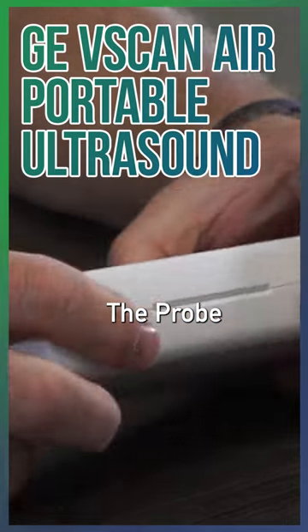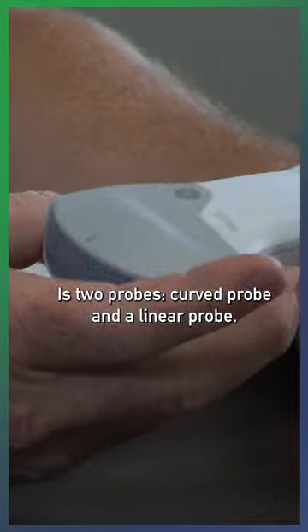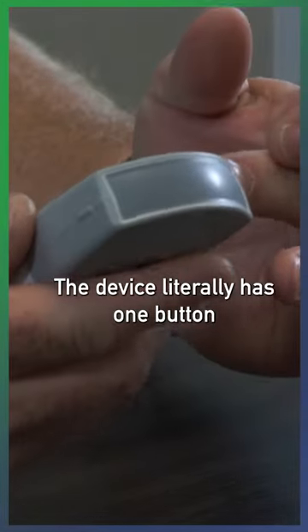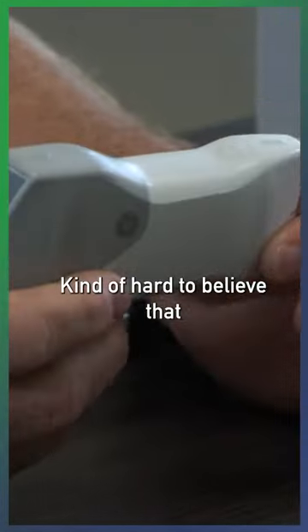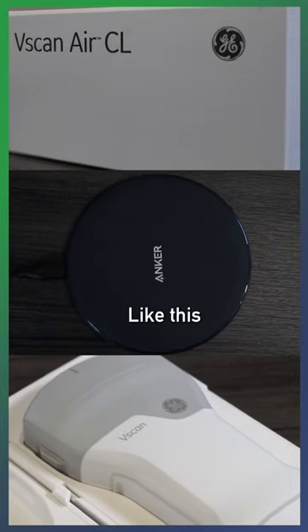The probe — it's actually two probes: a curved probe and a linear probe. The device literally has one button. Kind of hard to believe that you can get this many features packed into a small device like this.